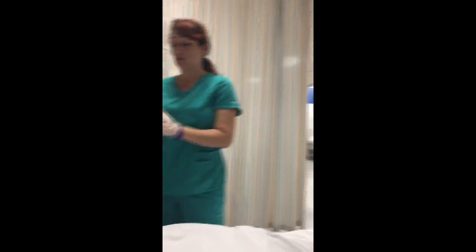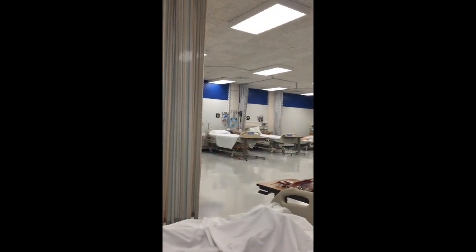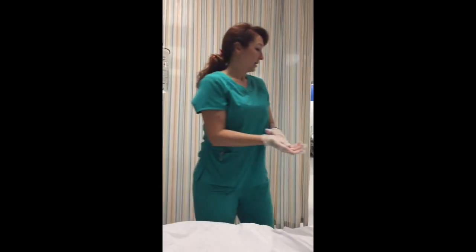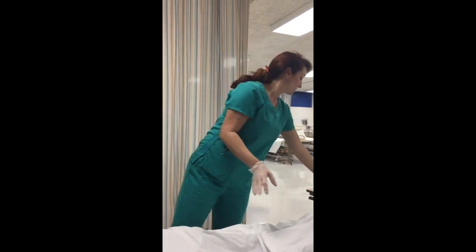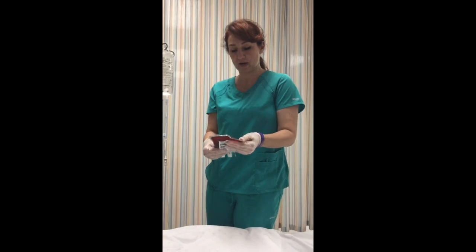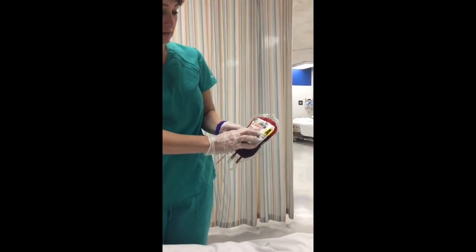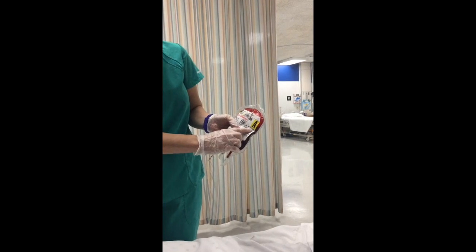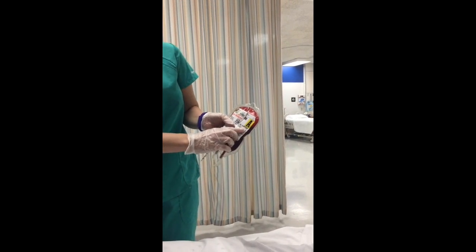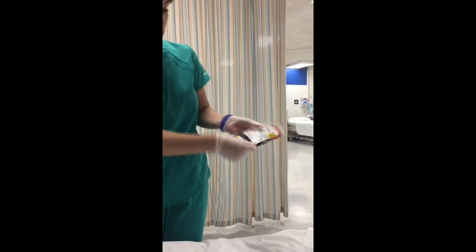Thirty minutes have passed. We're ready to infuse. We have our RN here to help us verify and get a baseline set of vitals. We're going to verify the blood type — packed red blood cells. We want to verify the type: it's A-positive. We also want to check the expiration date, which is right here.